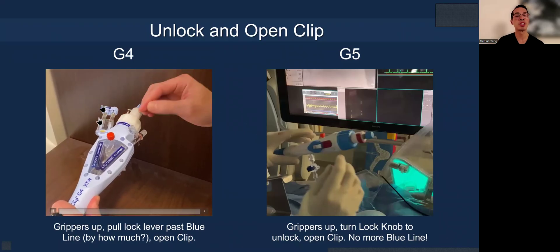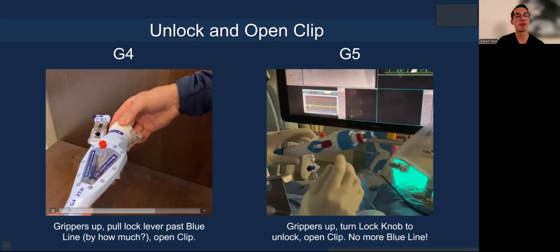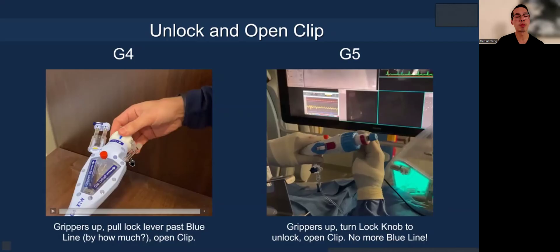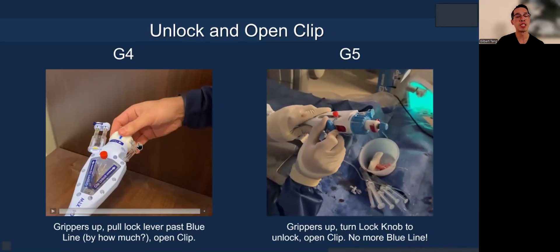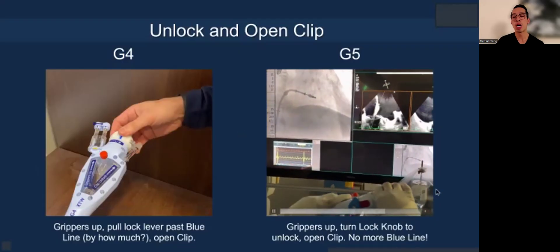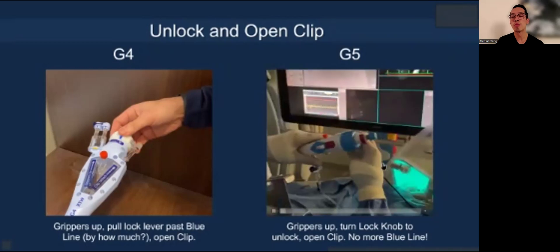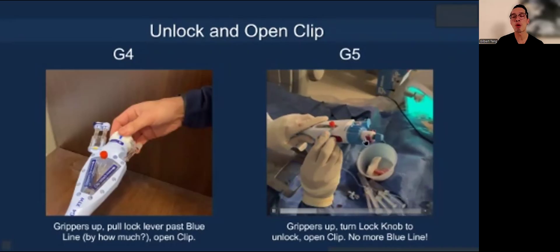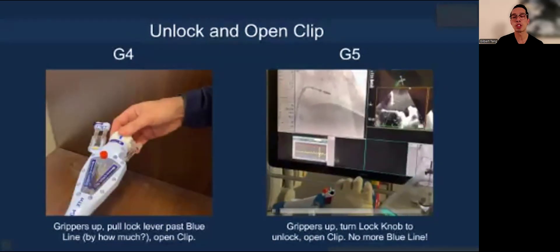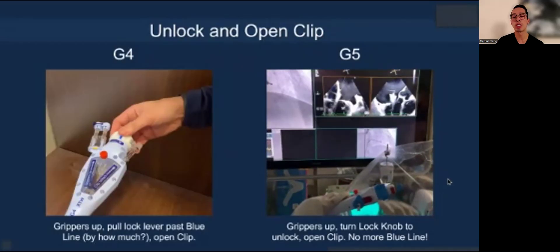How about unlocking and opening the clips? The G4 system was the first design to allow independent grasping and independent dropping of the grippers. But you had to raise the lock line past the blue line, and you never really knew how much to do. Sometimes when you raised it, you weren't able to open the clip and had to re-lock and unlock again — quite cumbersome. With the G5 system, it's very straightforward. The gripper mechanism is the same but done much more smoothly — safer and more effective for dropping and raising grippers. You just turn the lock knob to the unlock position, open, and you're done. No more blue line — very easy to check orientation and grippers right away.